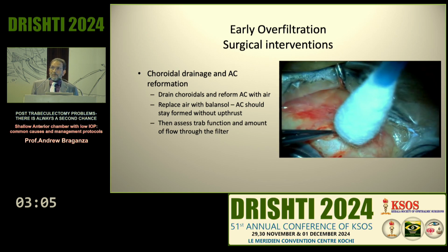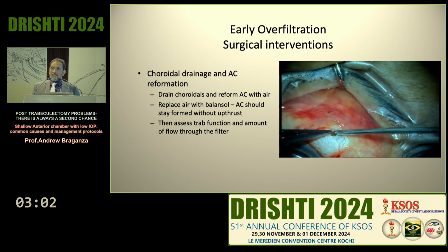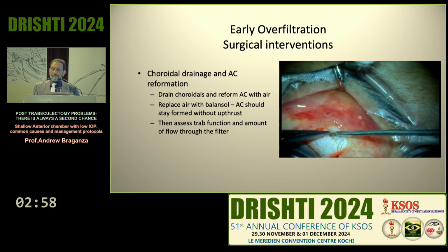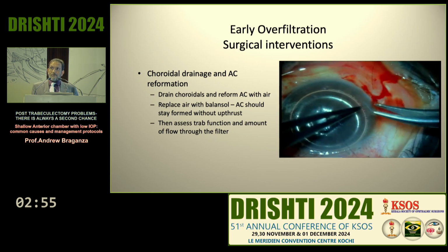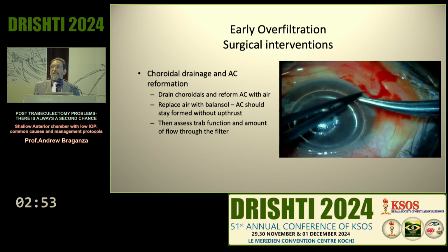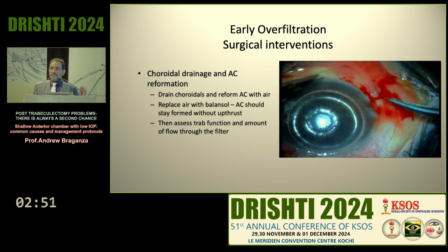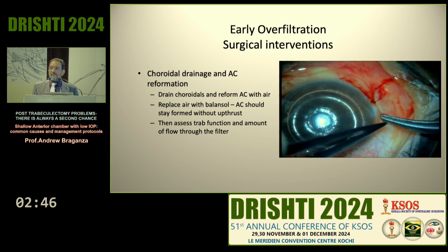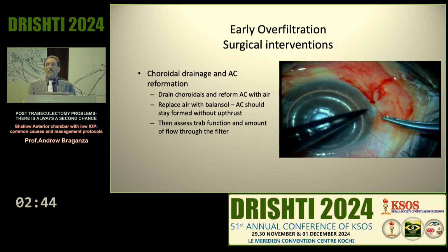This step is important where you try to cauterize the edges of your drainage site so that it stays open post-operatively. It needs to continue to drain in the first few days post-op, and you don't need to worry that it's going to stay permanently open. The sclera heals very fast. Probably in a week or two, it would have closed off. I have had occasion to go back and look at a choroidal drainage site 2 weeks later, and I found that I couldn't even find where the incision had been made.